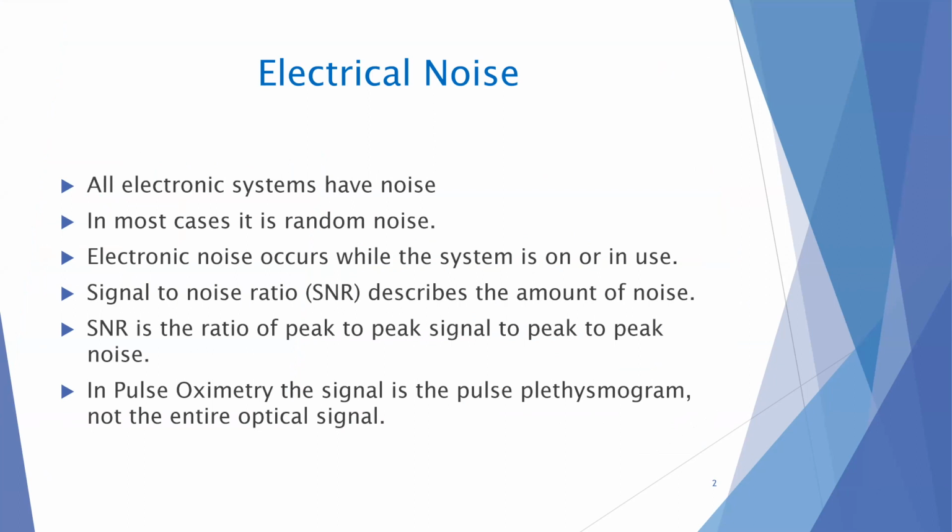Another question from Josh Pfeffer at the FDA. He commented that actually your results showed a negative bias for white subjects at low saturation, did they not? I believe that's correct. There's a slight negative bias, but it's small. It's much smaller than the large positive bias in darkly pigmented subjects at low saturation.